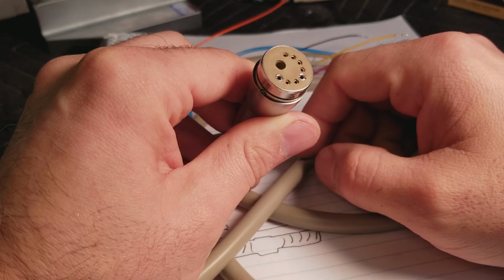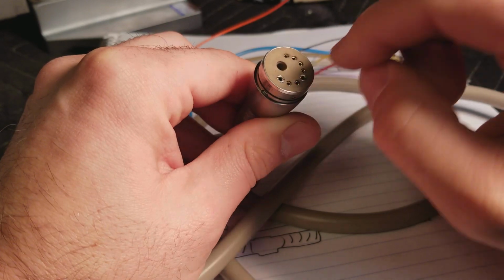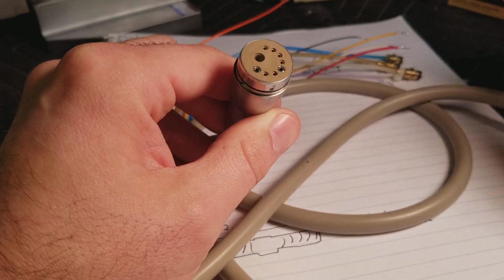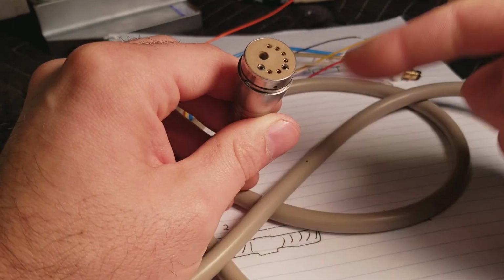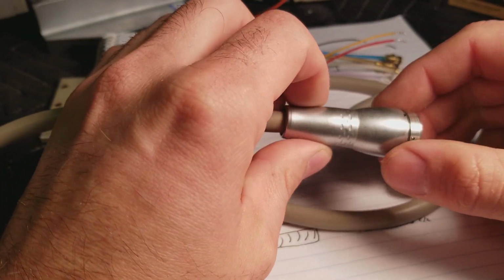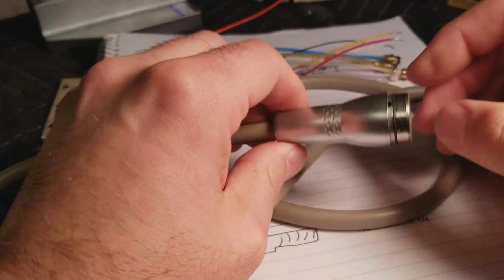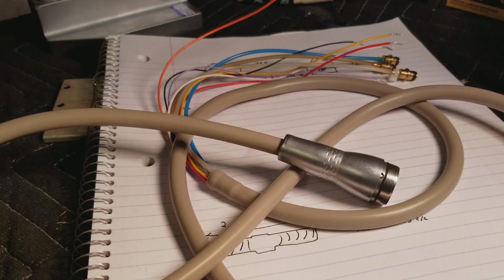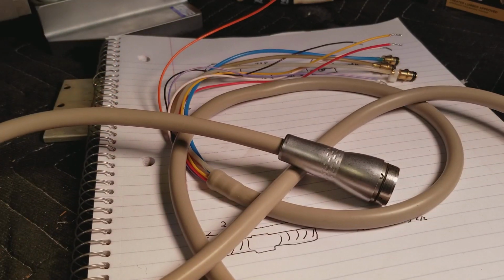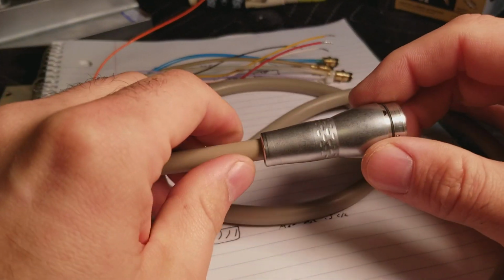In my case, on this cable, I found that the white lead did not have continuity to this, which indicates there's a break somewhere in the wire leading from this point to this point. So if any of you have attempted to look at this in the past, it's a bit of a mystery how this comes apart. Basically what I wanted to do is just take this apart, splice the wire back together so that I could then fix the motor cable and keep it working.